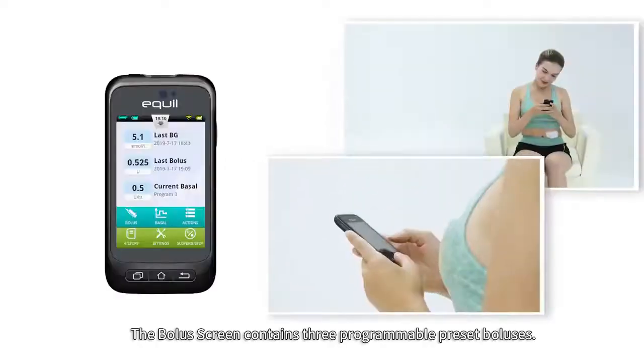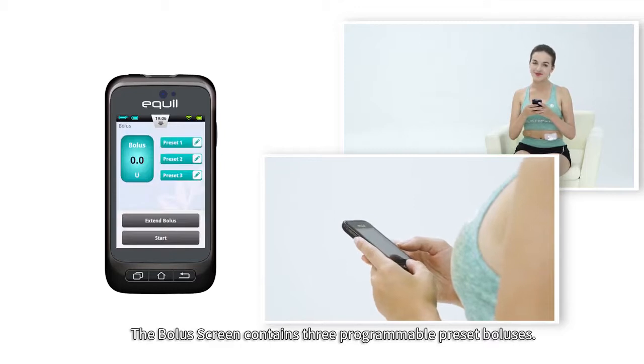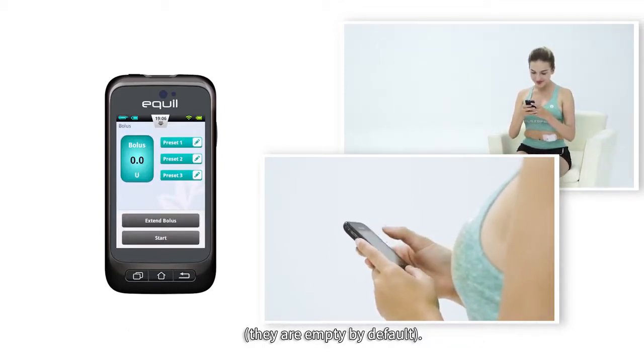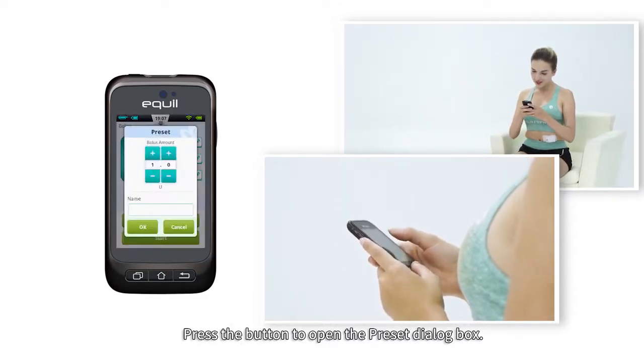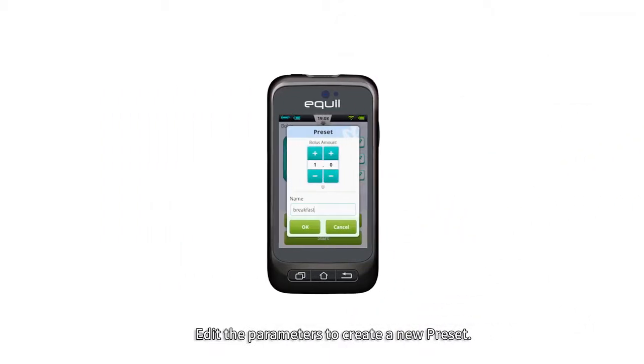2. Bolus Presets. The bolus screen contains 3 programmable preset boluses. You can set up each of the 3 preset boluses. They are empty by default. Press the button to open the preset dialog box. Edit the parameters to create a new preset. And you can change the name.